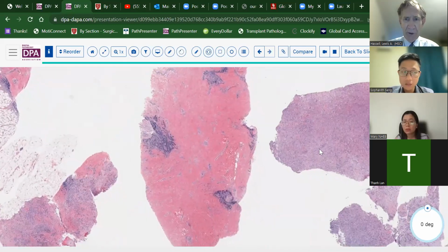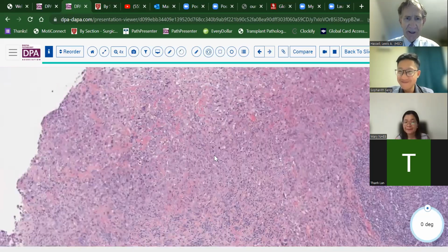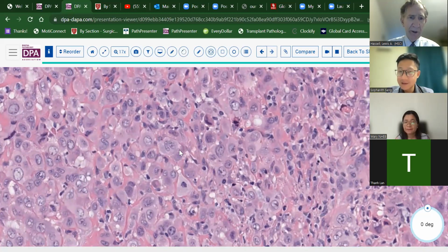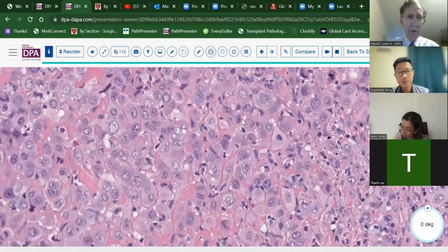And you're probably nodding your head and saying, "Oh, I know what this is." But this is an example of epithelioid sarcoma. And epithelioid sarcoma can be positive with cytokeratins, positive with EMA, but most importantly, it's negative for INI1. INI1 is a marker gene within what's called the SWI/SNF category of genes that is indicative of a number of tumors.